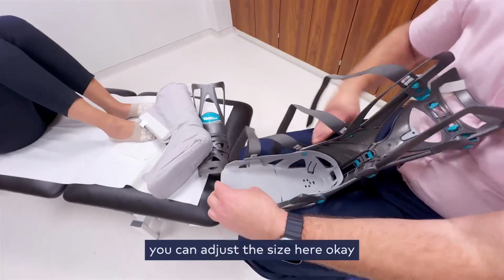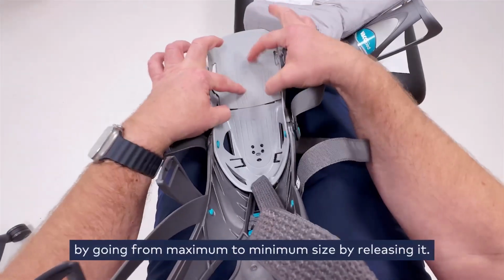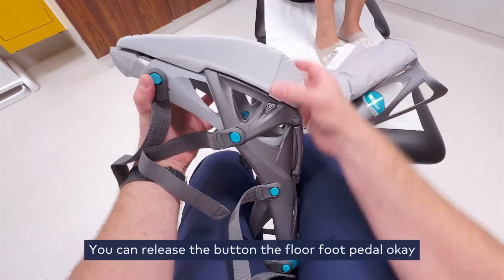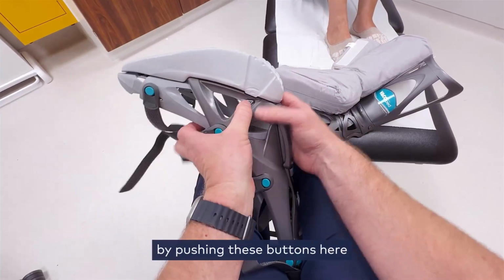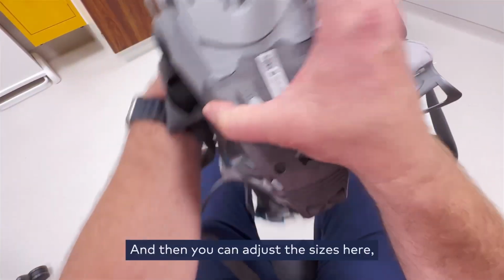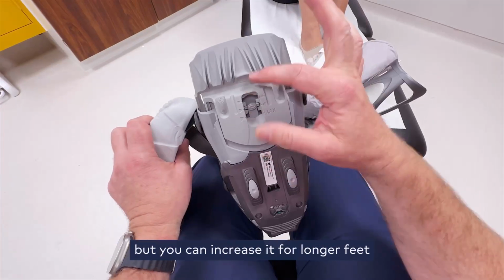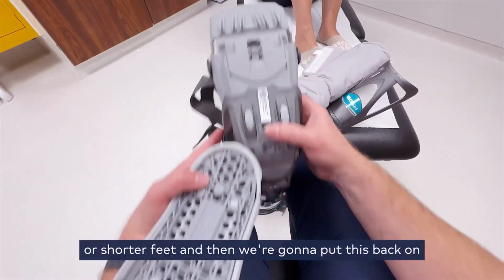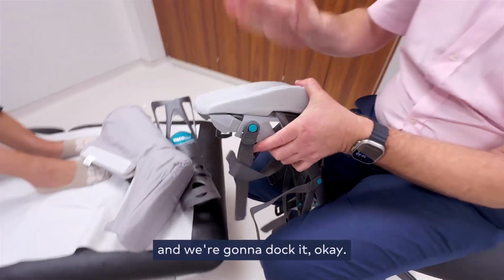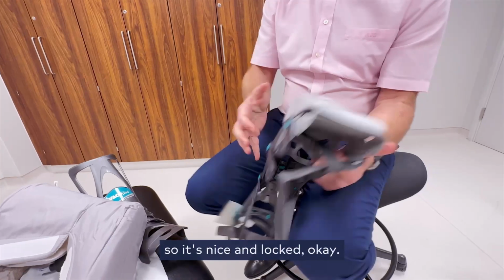You can adjust the size here, going from maximum to minimum size by releasing it. You can release the foot pedal by pushing these buttons here. So you can push one and then the other, and the foot pedal comes off. Then you can adjust the sizes here, maximum to minimum. I'm not going to do it now, but you can increase it for longer feet or shorter feet. Then we're going to put this back on and dock it. There should be 4 clicks for it to sit back on so it's nice and locked.